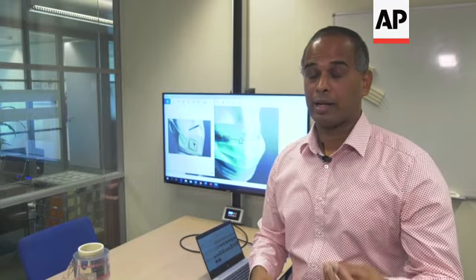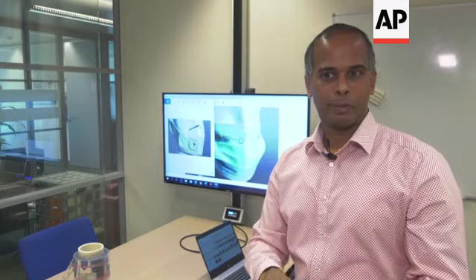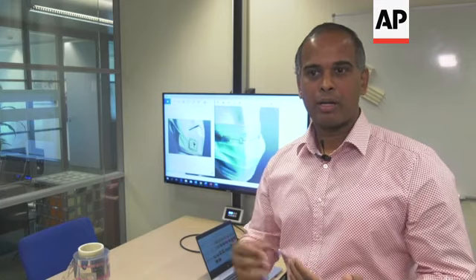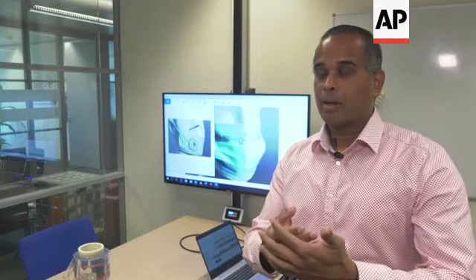So you can think of putting smart electronic functionalities, like a respiration sensor, like a temperature measurement sensor, to know if the wearer is doing well, or if not, indicate by, for example, a haptic vibration saying, hey, it's time you stop and go away. On the other hand, there are people who buy masks and wear them for more than the duration intended. So by measuring the humidity of the filter, you can also indicate that the mask cannot be used anymore and you have to replace the mask so that the effectiveness is retained.